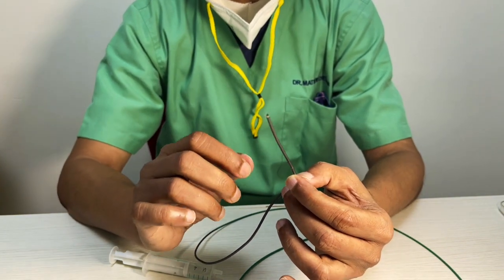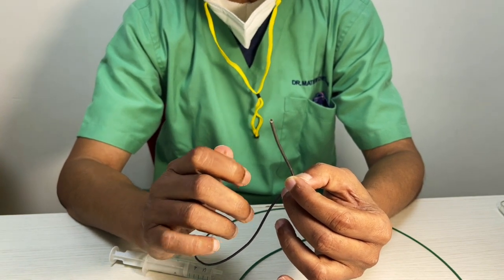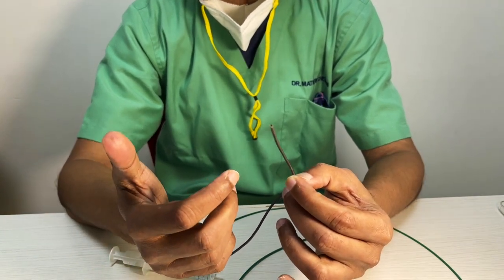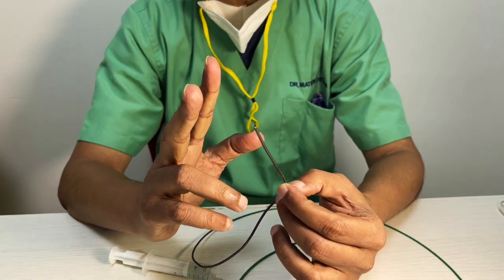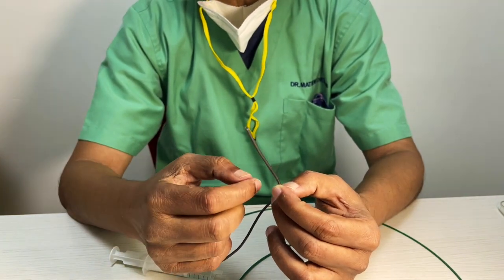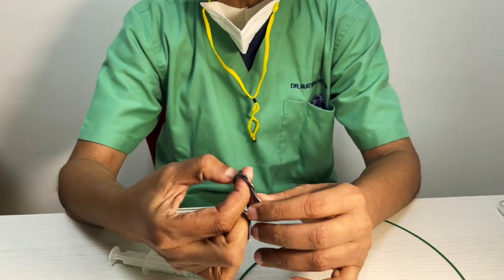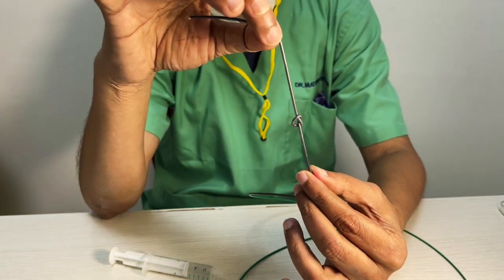Now it's mandatory that we use every device today for suction which has got an inner sleeve, because we're going to pull the stent retriever inside. Take Sophia for the matter. Sophia is very trackable, extremely well designed, but the problem is the tip doesn't have the sleeve, and because it doesn't have a sleeve, when you pull it back, it will tear the distal end of the Sophia when you do a Solumbra technique. So for Solumbra, you need that. So have a look at it. Like I said, you can try the knot test again if you want and see. It will work perfectly okay, and this will go through.